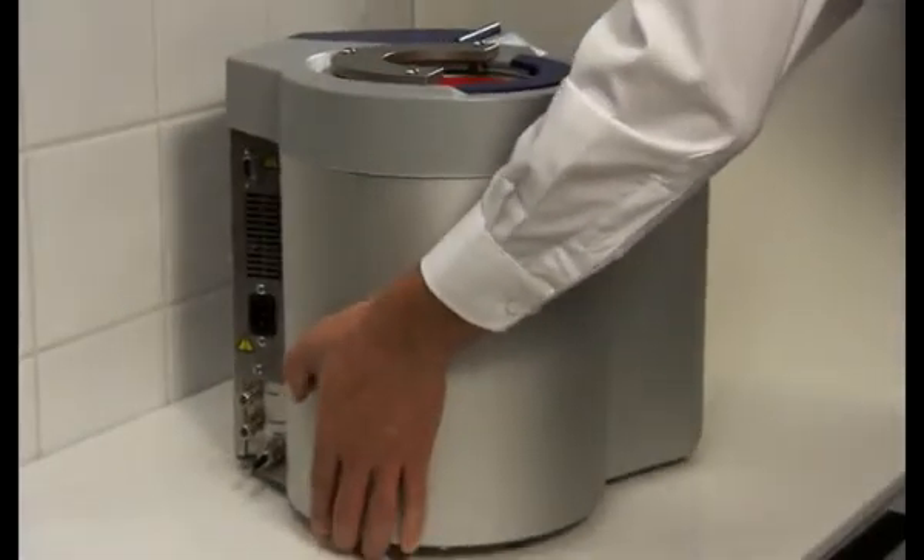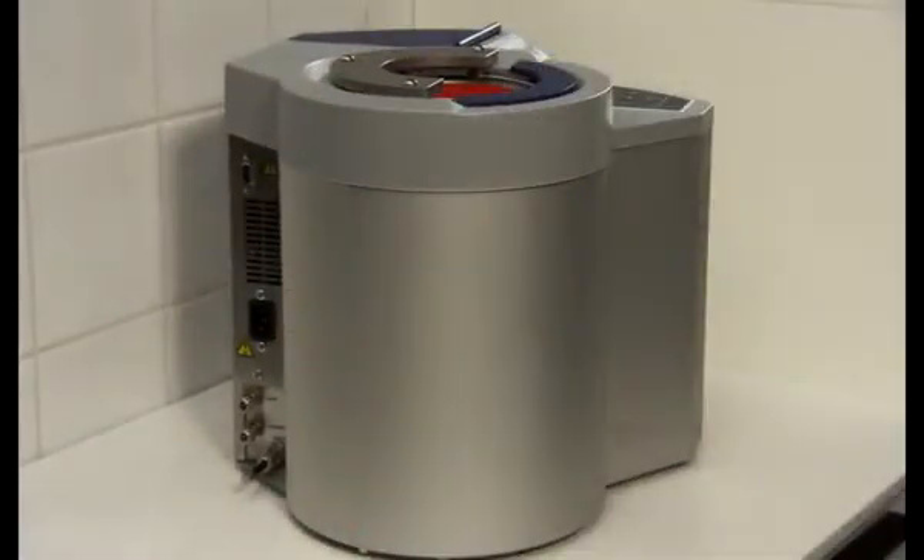Place the DAC Universal on the table. The minimum free space required is 10 cm to the wall behind the autoclave and 70 cm in height, which is the distance between the base and the lid when fully raised.